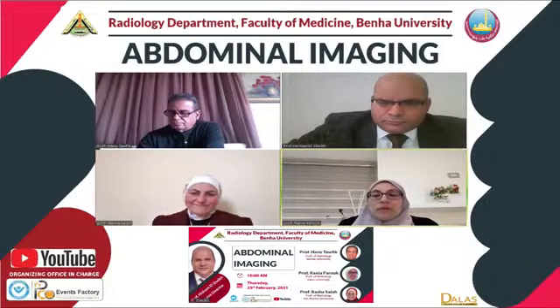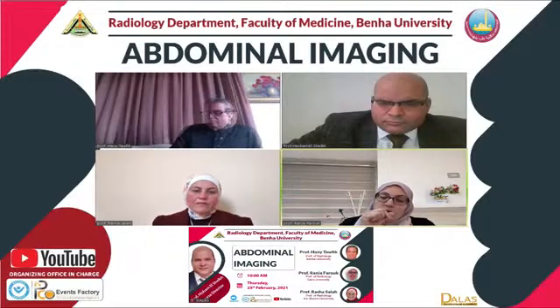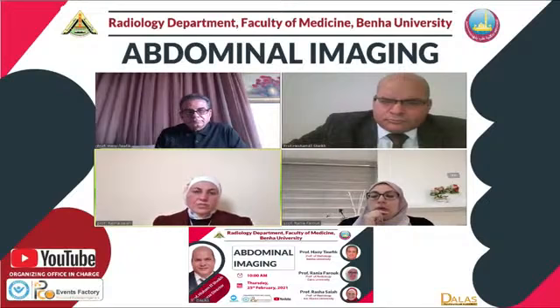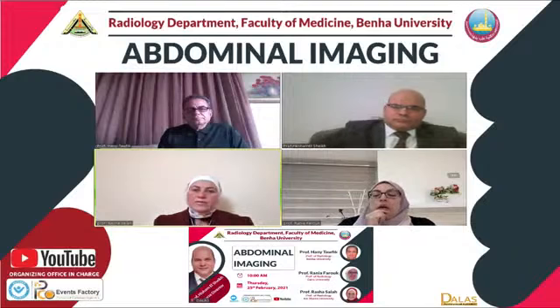طب لو بتعملي اسسمنت للانال سفنكتر بتاخدي لها كاتس ثانيه بقى، لانك انت بتاخدي السلايس ثيكنس بتاعتك متهيألي مش 3 مللي، هل بتاخدي سيكونسز مخصوصه للانال سفنكتر لو انت شايفاها له ريكتال؟ لو له باخد ديديكيتد على الانال كانال سيميلر للبيري انال فيستيلا علشان تؤسس فعلا في تريتمنت في انفلتريشن للانترنال سفنكتر ولا دخل على الانتر سفنكتريك سبيس ولا كمان فايوليتد الاكسترنال سفنكتر، لان ده بيفرق جدا في السيرجيكال بلان ان هو هيعمل انتر سفنكتريك ريسكشن ولا هيبقى ابدومينو بيرينيال، فده هتفرق كتير ساعات في بعض البيشنتس يعني.